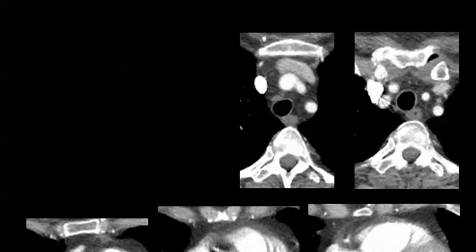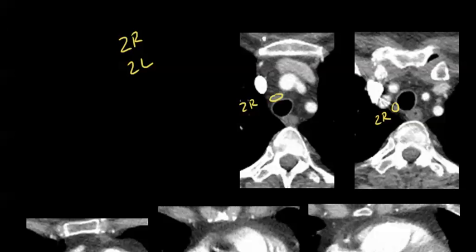I've brought us all the way up here to the level 2 lymph nodes — so these are the 2R and 2L lymph nodes. Here's a little 2R right there, and there is maybe another little 2R right here. Right here you have your innominate artery, here is your left carotid, and here is your left subclavian.